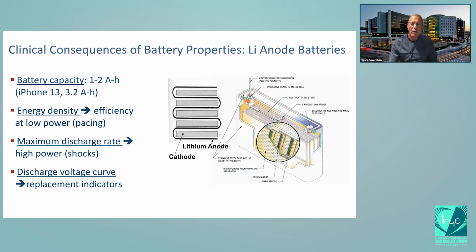Finally, I don't want to get into the weeds on battery design, but the basic concept of all batteries is that there are layers upon layers of lithium metal separated by a separator and then surrounded by some cathode. The goal is to make this separator as thin as possible, because all it does is keep the lithium and the cathode from reacting and shorting the battery, turning into heat, draining the battery immediately.